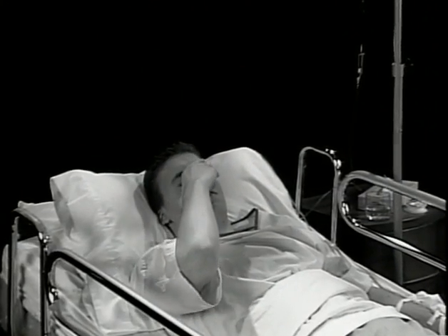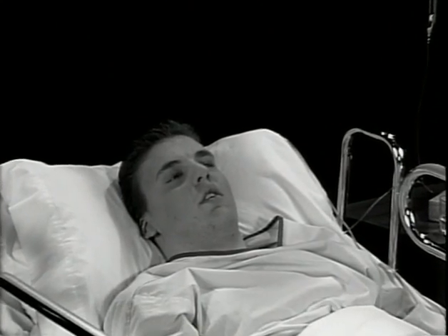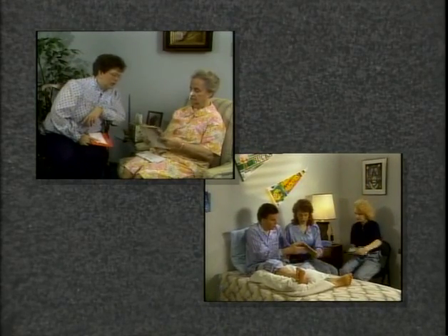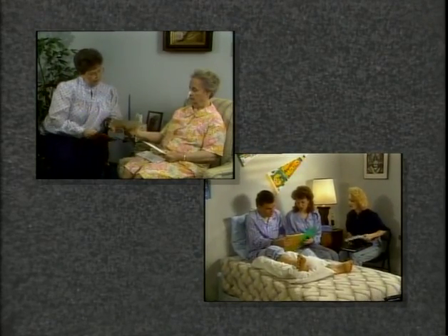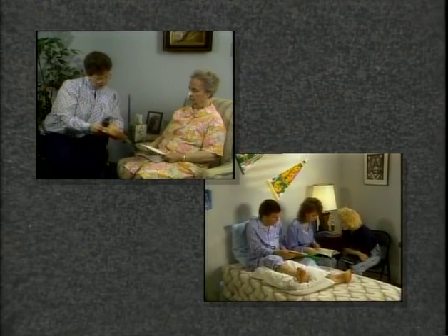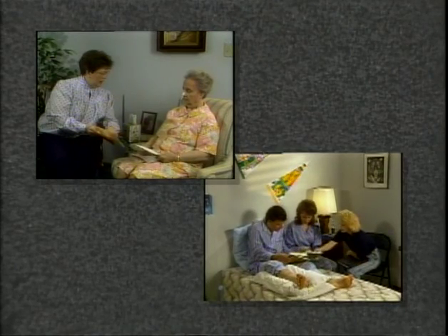With the pumps of the 90s, patients do not have to be in a hospital to receive infusion or enteral therapy. Agnes Brown is with her family, getting stronger by the day. Soon she will move back to her own apartment. John Williams Jr. will complete his antibiotic therapy in another week. He has kept up with his classwork and will graduate with his class. Agnes, John, and thousands more like them can be treated at home where they can enjoy life to the fullest quality possible with family and friends.